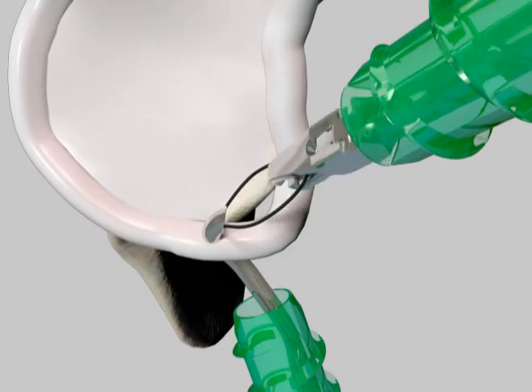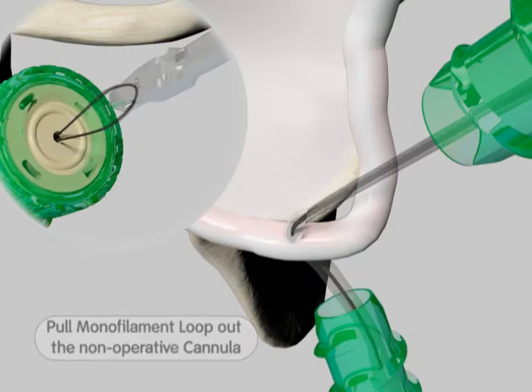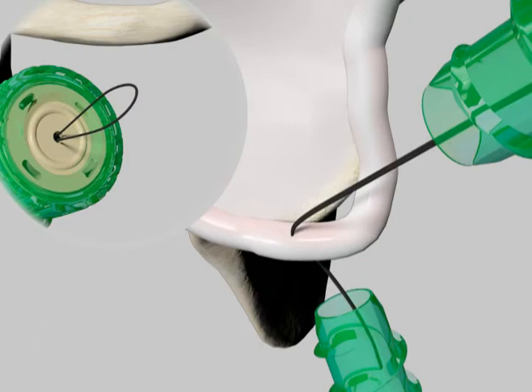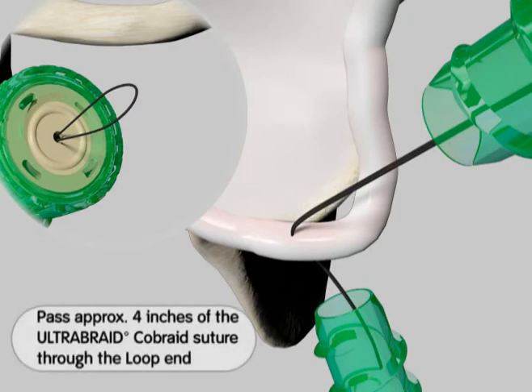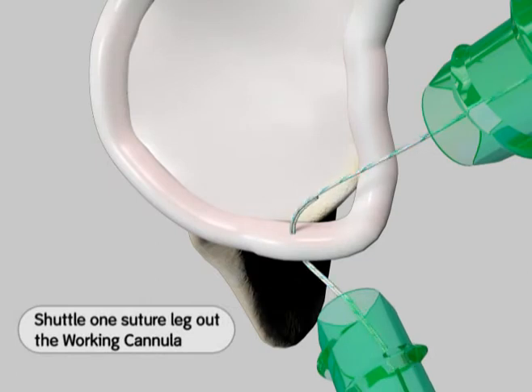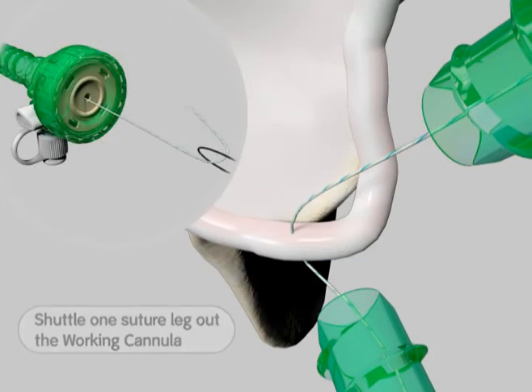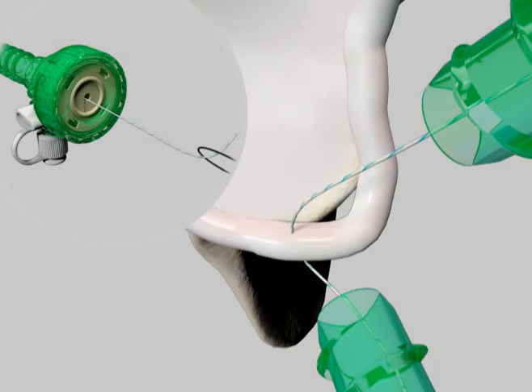Use a grasper to retrieve the monofilament suture loop through the non-operative cannula. Remove the shuttling device, leaving the monofilament suture tails exiting from the operative cannula. Pass approximately 4 inches of one limb of the ultrabraid suture through the loop end. Shuttle the suture through the tissue by pulling the monofilament tails away from the working cannula. Once the suture limb has been retrieved outside the cannula, discard the monofilament.